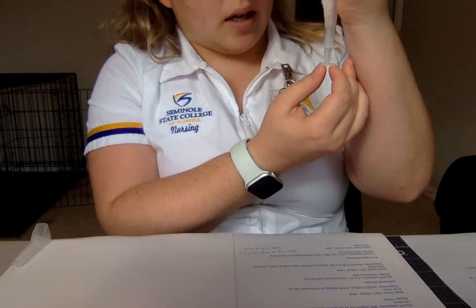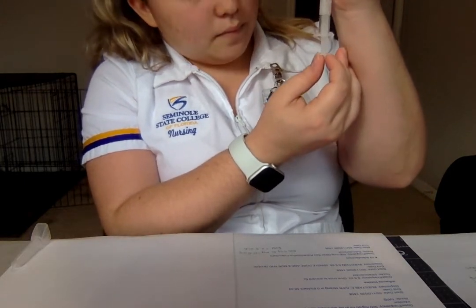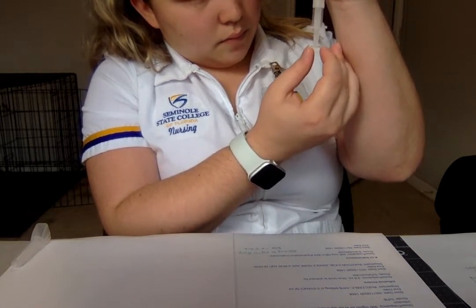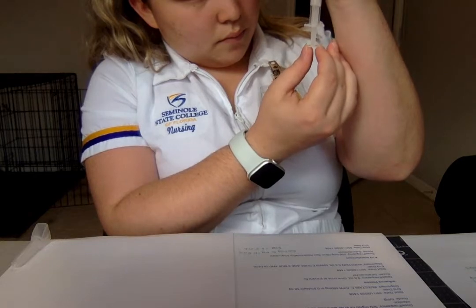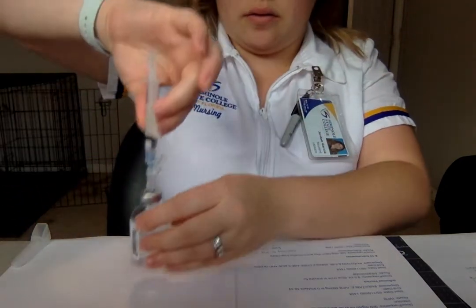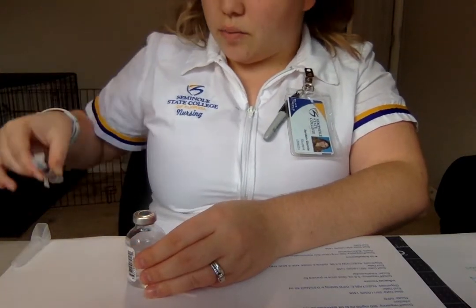And again, I'm doing this at eye level so I can make sure I get an accurate dosage. Okay, I pulled out my 0.5 mLs. Pull it out, and I'm going to go ahead and do the one-handed scoop.